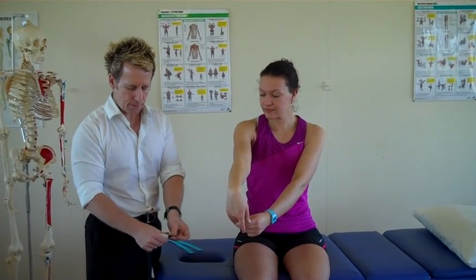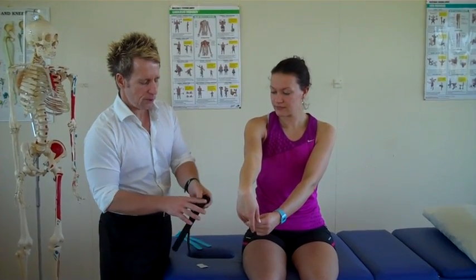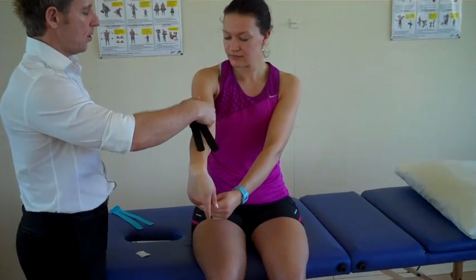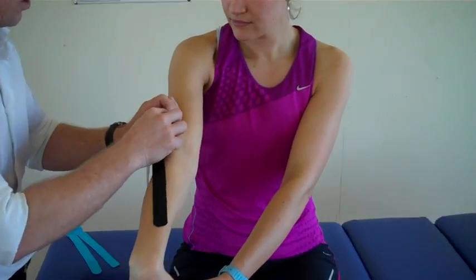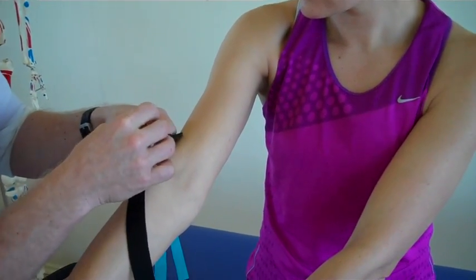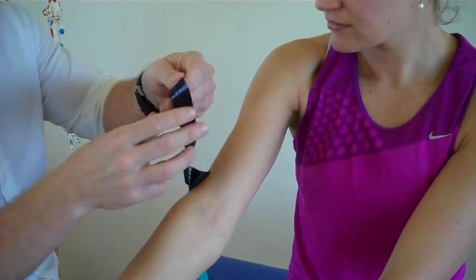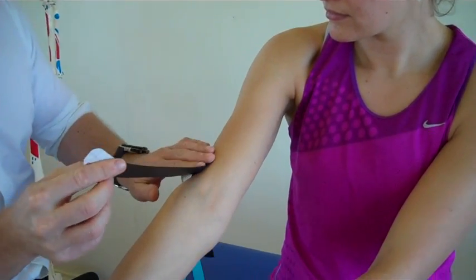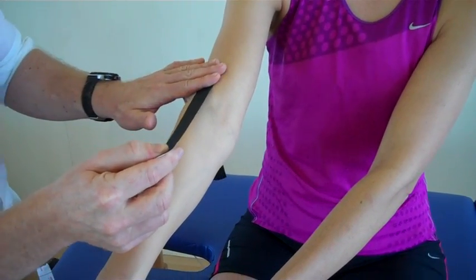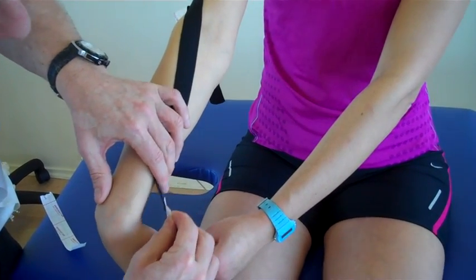Using the back of the tape — we split the tape because the initiation of the tape, the beginning, is no stretch — we apply that just above the lateral epicondyle. Then we've got the two legs, so we just break that seal and do one at a time. We split that tape and leave one leg to the side. Because the tissue is already on stretch, we apply a slight bit of stretch and come down, and that will just feed around like so.